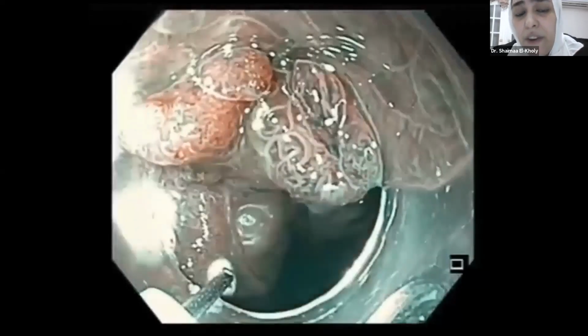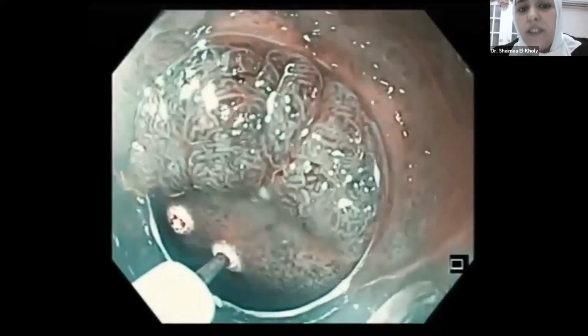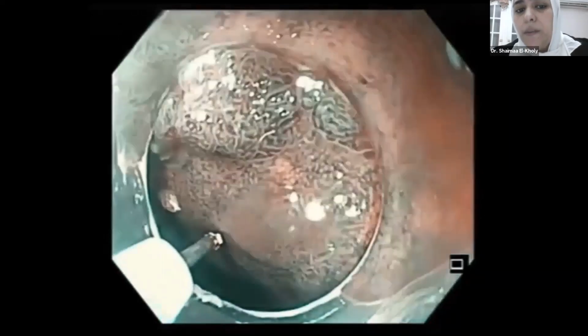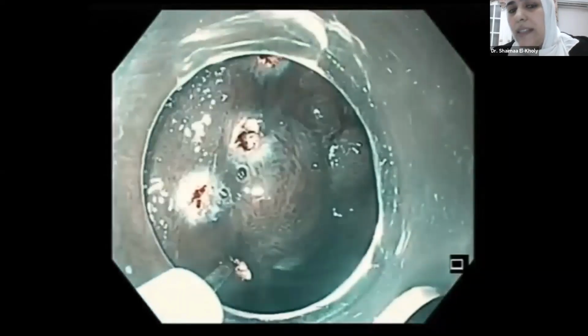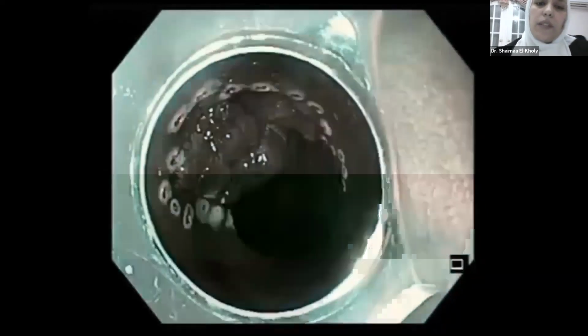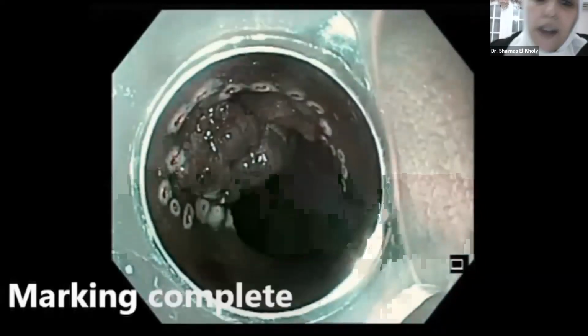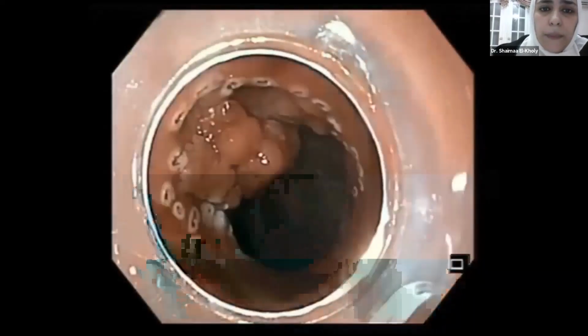And it's very important that you clean your field very clearly and you inspect every part with narrow band or chroma endoscopy just to guess if there is a suspicious invasion or not. And as we finish our marking, we see that the lesion is big. It's occupying about 70 or 75% of the circumference. And then after the marking, we will go with the circular incision.